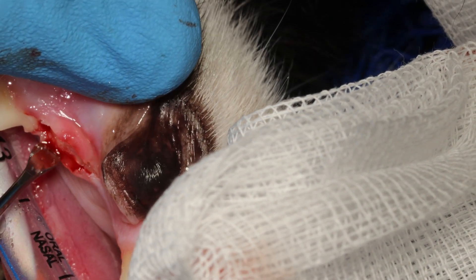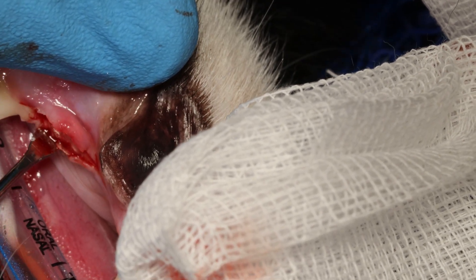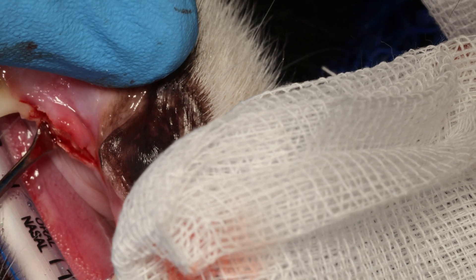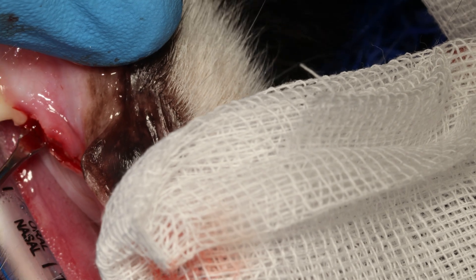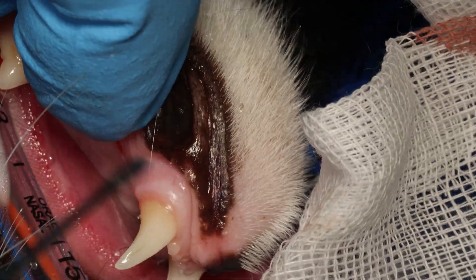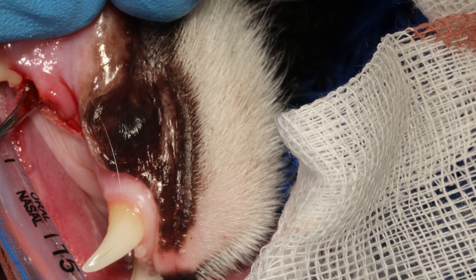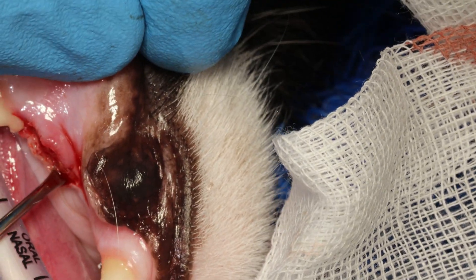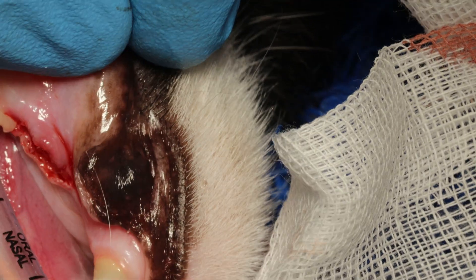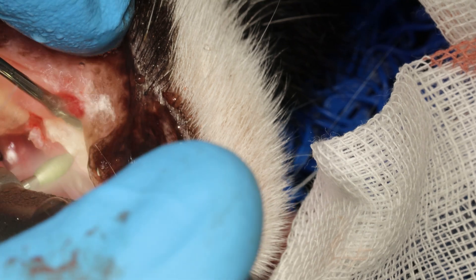Very importantly, you have to release the lingual side also. Use your periosteal elevator again and gently try to get between the bone and the lingual gingiva and mucosa. Release it a little bit off the distal root of the adjacent tooth — you have to do that to be able to make the flap properly. Move sideways to release that tissue from the bone.